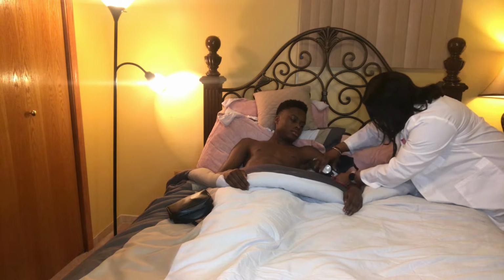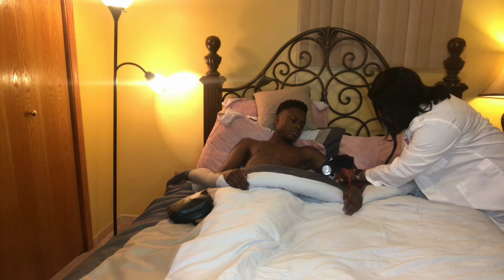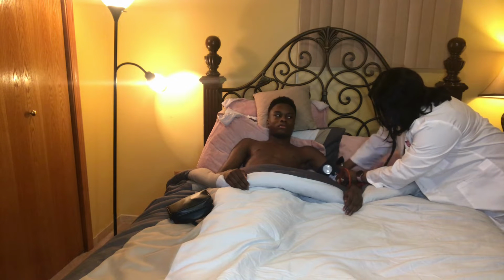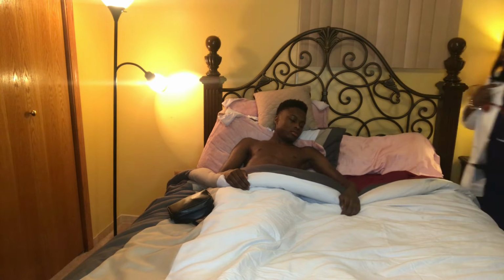I have the cuff wrapped around your arm, which will be doing the reading for us today. Your blood pressure on the left arm reads 108/62, which is not much of a difference.